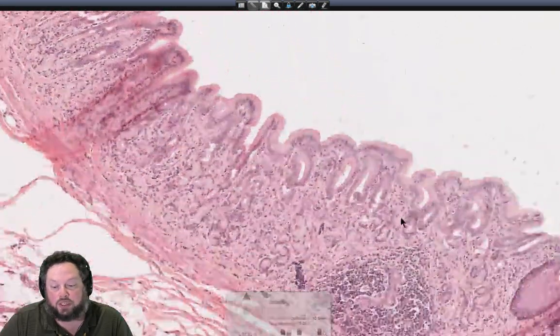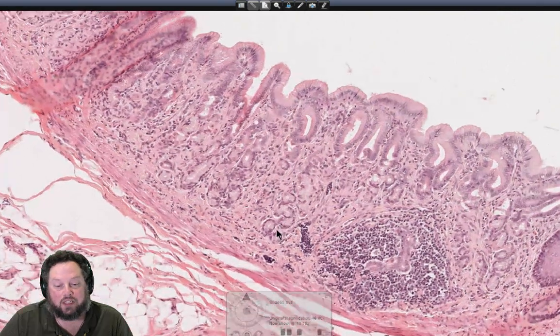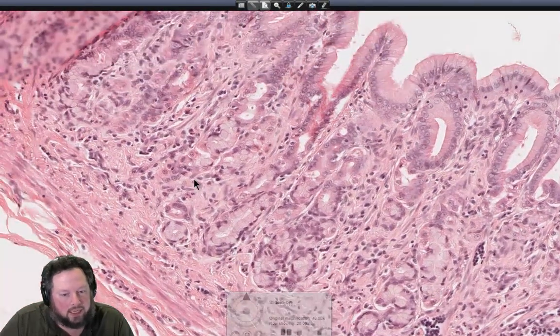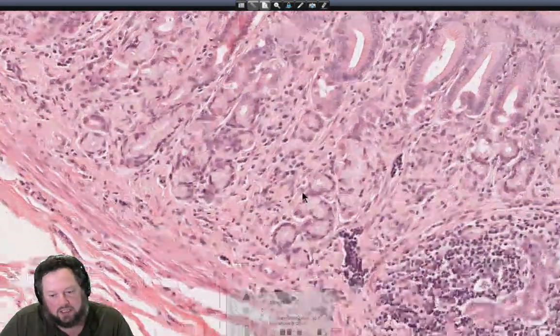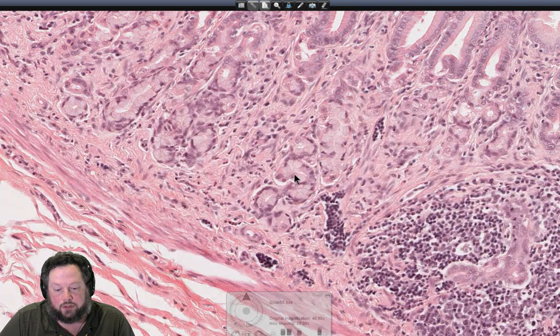But otherwise, what you look for is gastric pits, which are about 40% the depth, and very sparse mucus-secreting glands, so there's no evidence of parietal cells or anything else. These are actually made up of mucous neck cells and enteroendocrinocytes. The enteroendocrinocytes are a bit tricky to see. I don't think I've ever seen them in any of these slides, but sometimes you can get some really nice sections and actually see the enteroendocrine cells, particularly at the base of the glands.